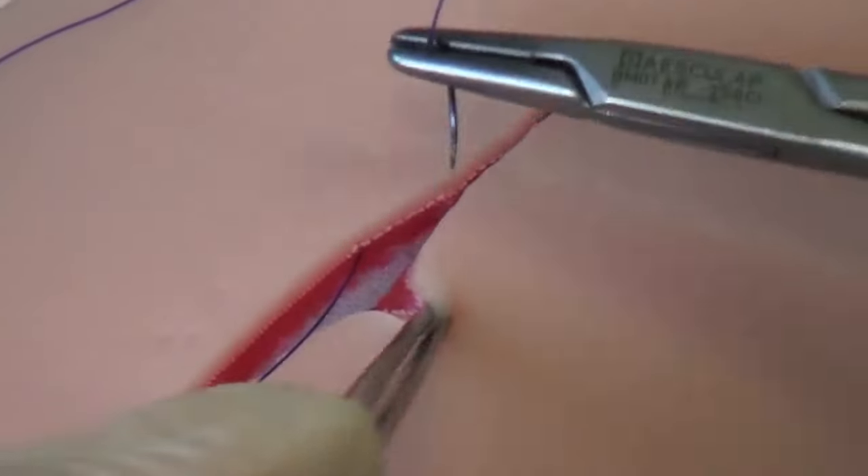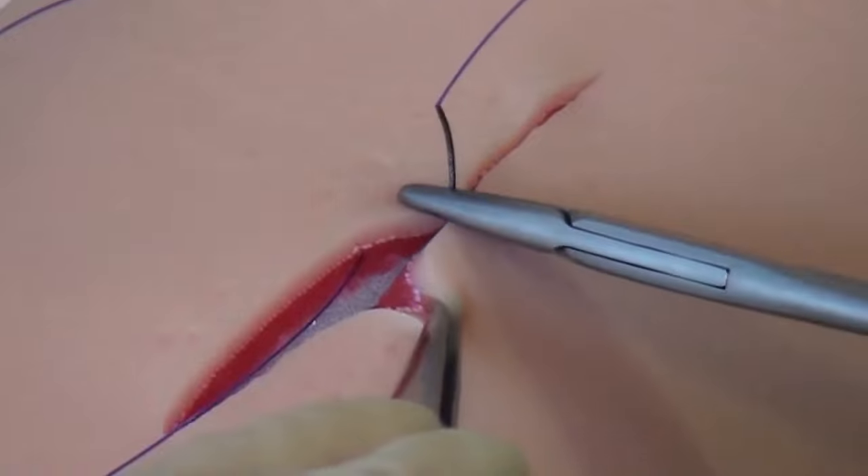The subcutaneous suture is used for closing the subcutis. Therefore, an absorbable thread is used.